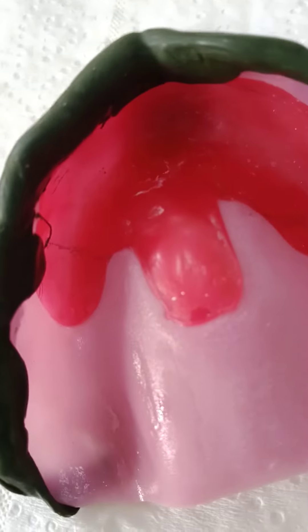For four or five reasons. One: this extension into the fitting surface might be sharp, so you need to remove it. Second: it might prevent the seating of the tray into the full depth. So you are putting the tray in and border molding while the tray is not totally seated.